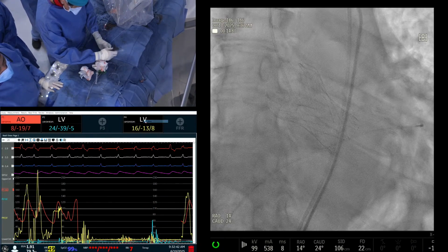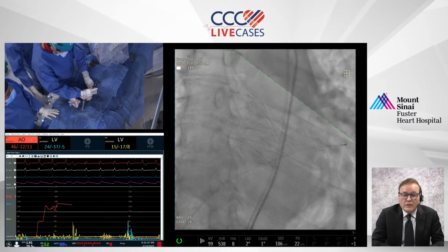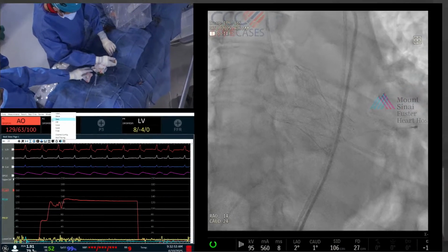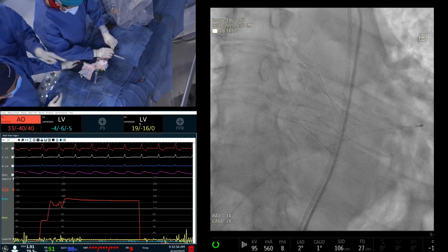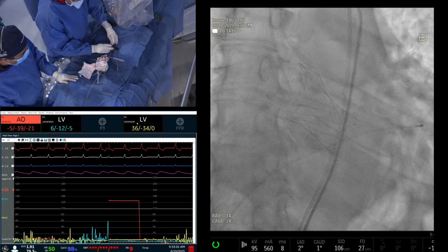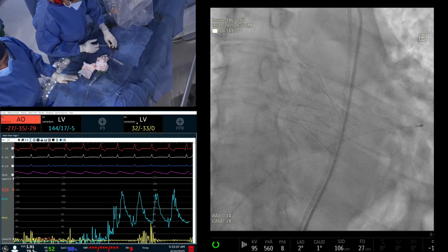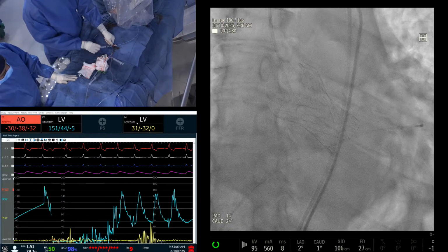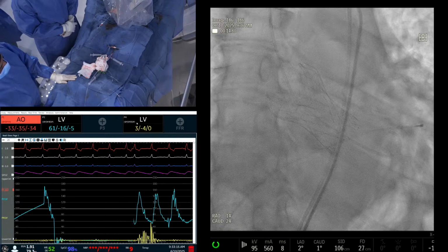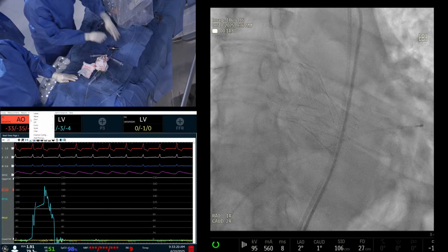So we have another question about the embolic protection device. Yep, so let's just comment on this for this case. Now the question comes: the two major trials, BHF PROTECT and PROTECTED TAVR, both showed no benefit in overall stroke, but there was a little signal in disabling stroke. So that's the only one that remains. So the question is, is it worth trying to decrease that and of course going through all the hassle and timing? If really effective, then we do. But when it's borderline, people have gone away from it. But the field has not ended yet.